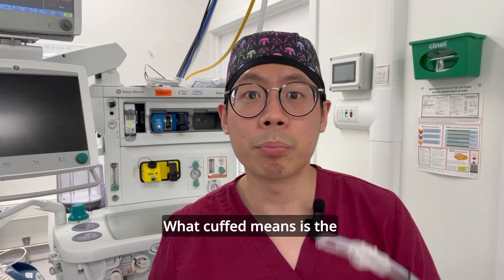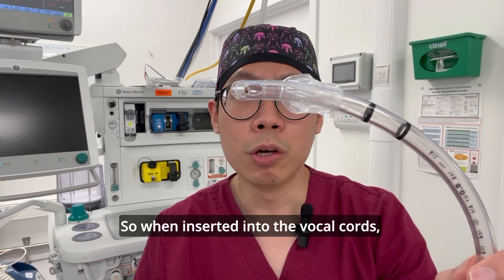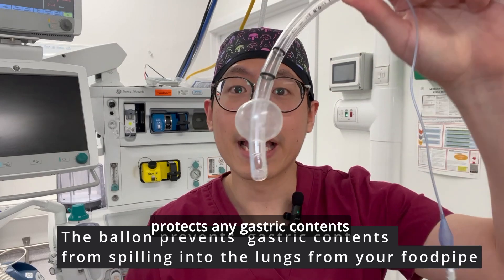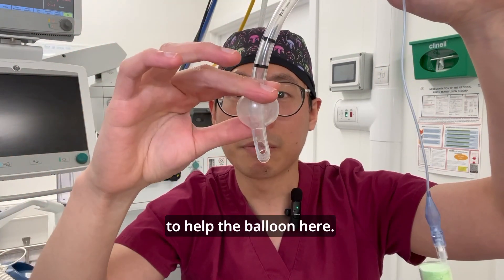What 'cuffed' means is the presence of a balloon here — so when inserted into the vocal cords, we can actually inflate the balloon, which protects any gastric contents from going into your lungs with the help of that balloon.